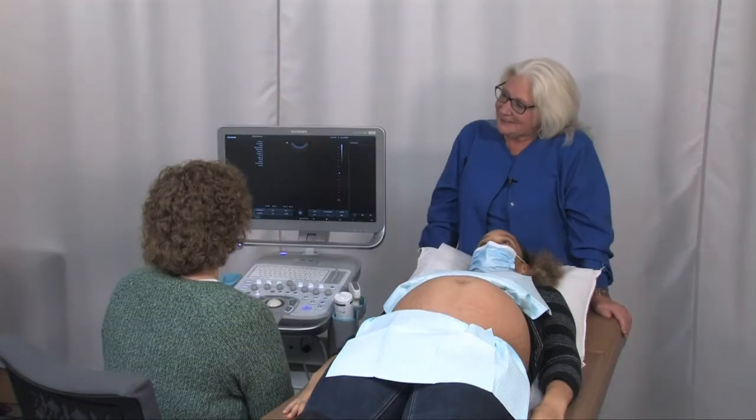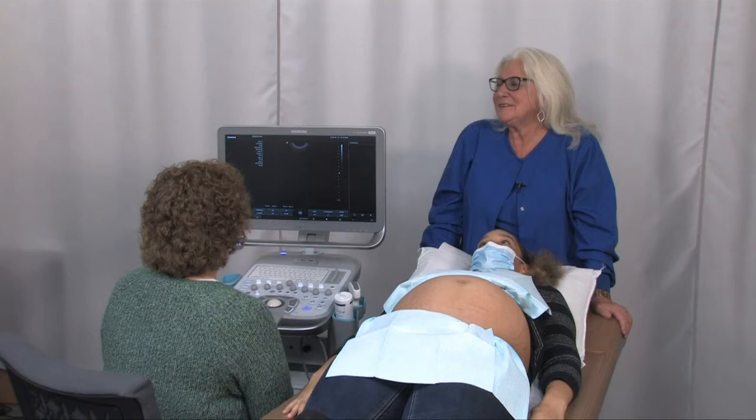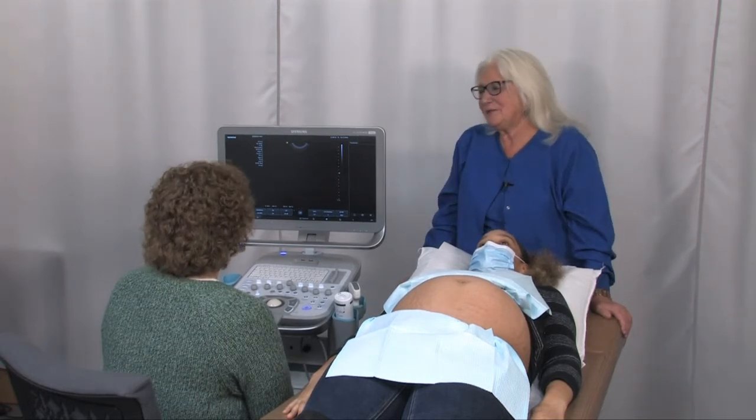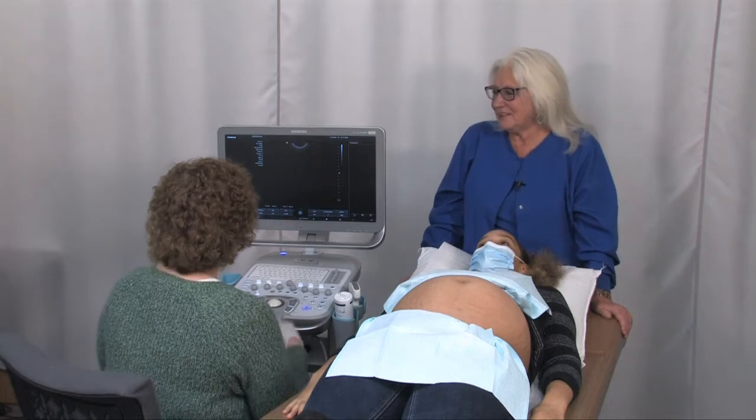So we're back again, me and Robbie. Robbie, we want to start from the beginning, getting the patient information, setting the presets, all that. So why don't you go ahead and show how to do that?